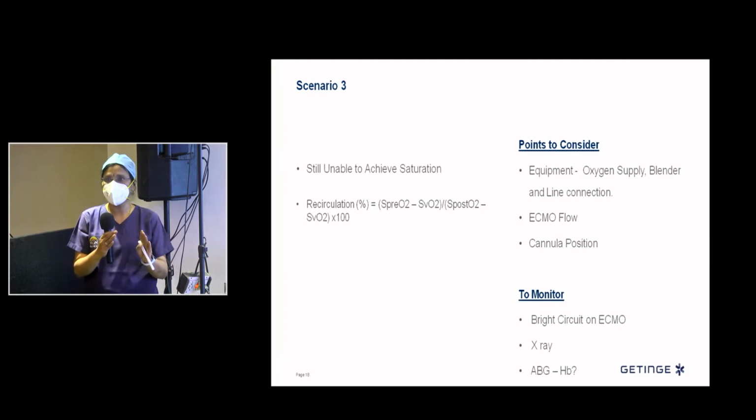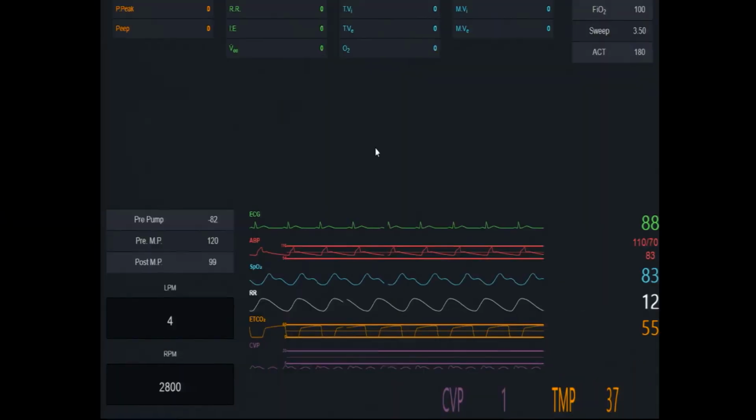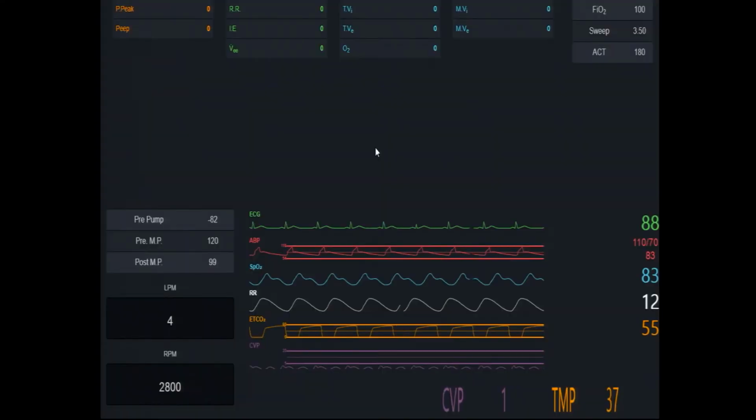It's easy to reposition a groin cannula than the neck cannula. So first try with the groin reposition. If you are satisfied, leave it. Otherwise, the neck cannula also you can reposition. Measure how much you want to remove, and then you can reposition. Yeah. Next.